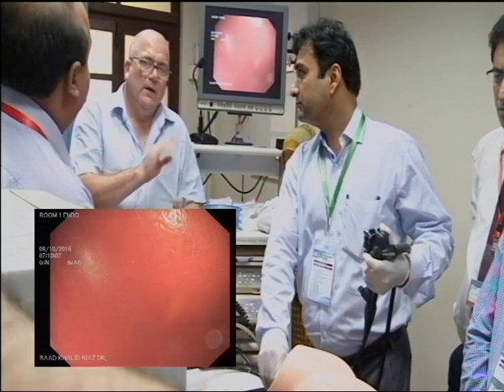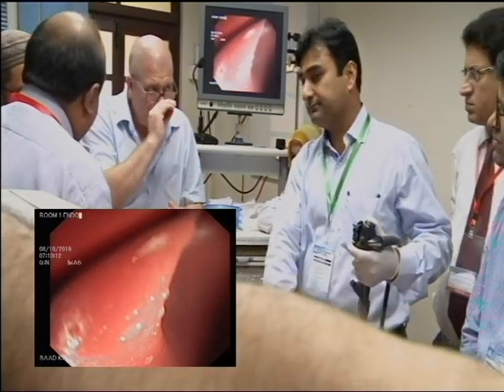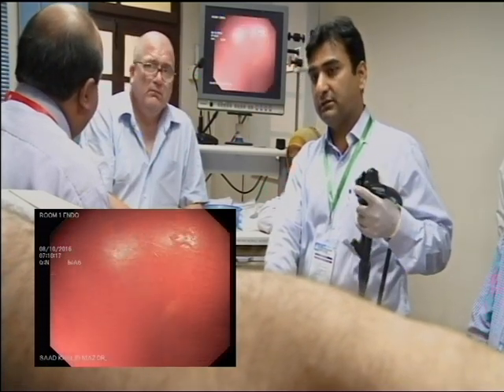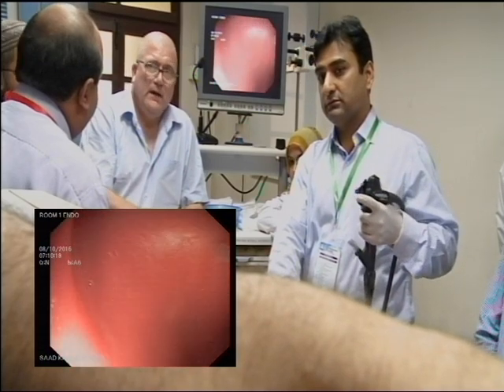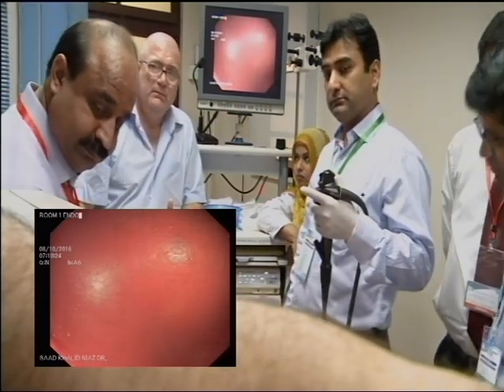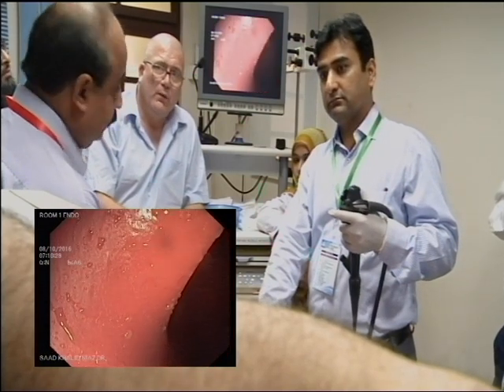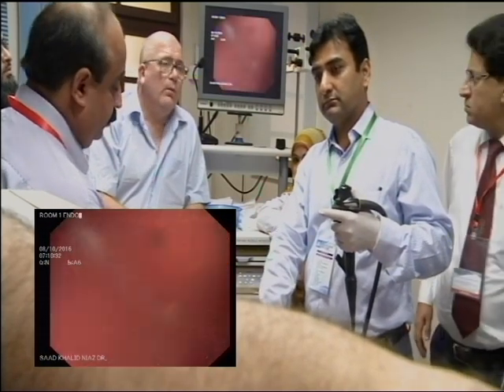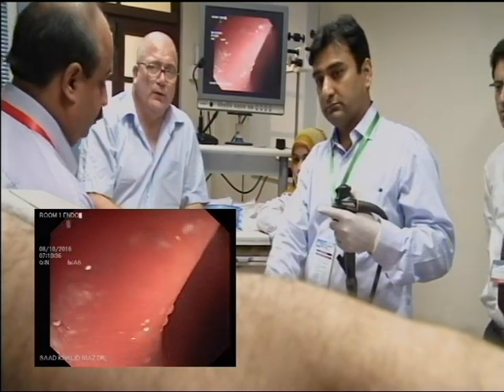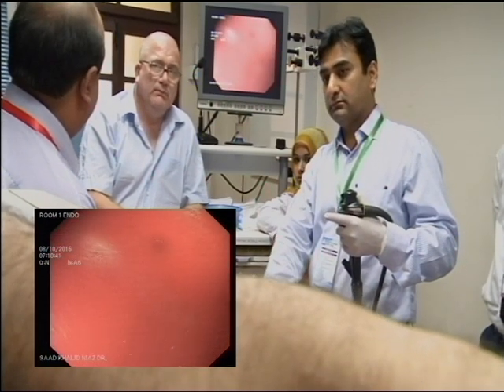Stop. At the moment again you're throwing everything at us. If you slow down, where's the lumen? Let the scope relax in the right hand. Now draw the scope back a centimetre. Put a clockwise torque on the scope. Right. Why is it not working? Now put an anti-clockwise torque on the scope. Anti. Why is that working?